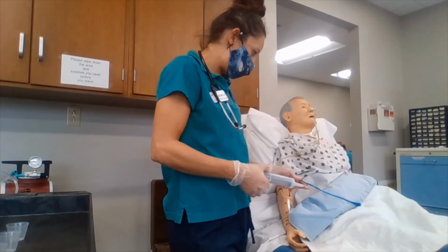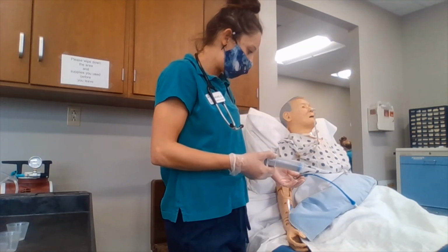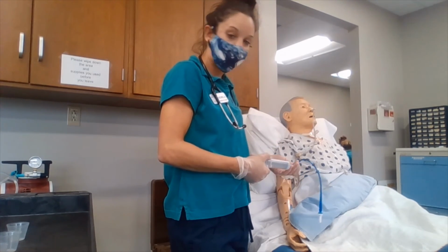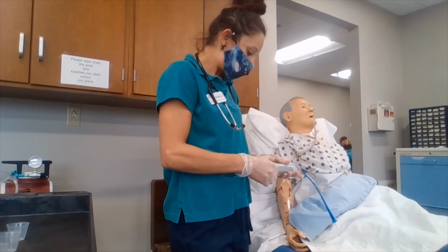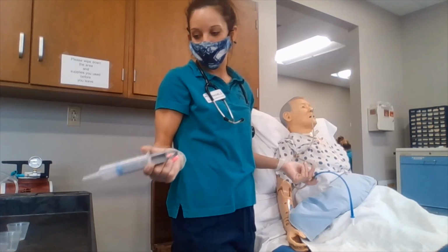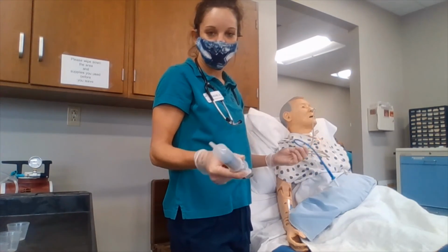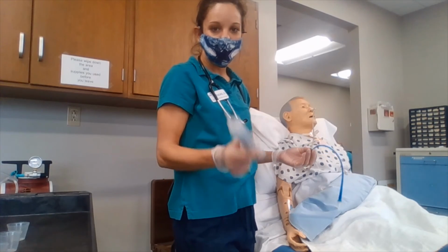So we are going to be verifying placement before we administer medication. We are going to be aspirating stomach contents, and we will withdraw it. We would put it in and check our pH balance. Anything under 5.5 usually indicates gastric contents.